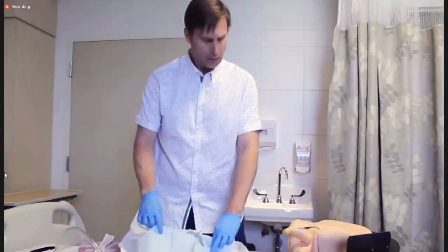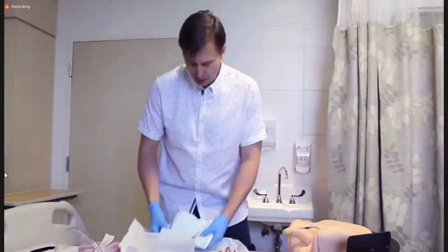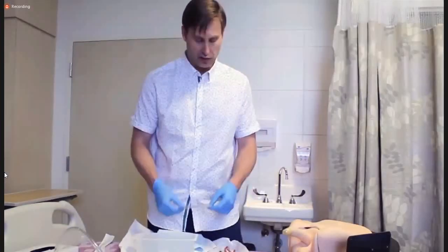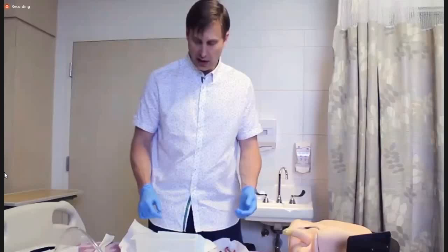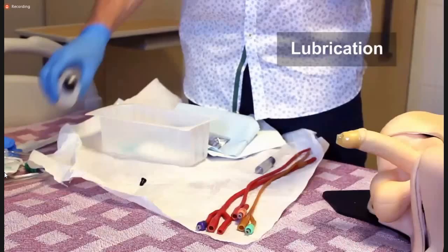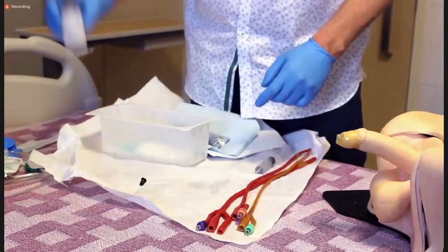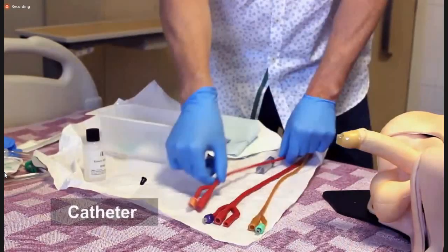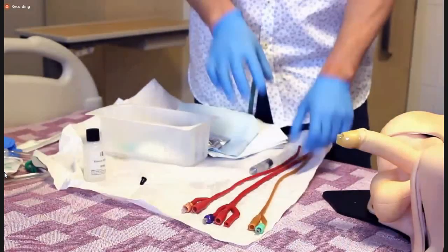Once you have your sterile drape, you'll also need your cleaning solution. In this case, it's a betadine solution. You'll also need lubrication, usually some form of jelly lubricant or other various forms. You will also, of course, need your catheter, and they come in various forms, and we'll review each of those near the end of the video.